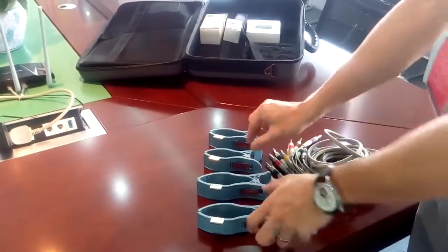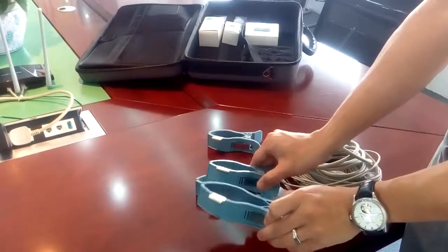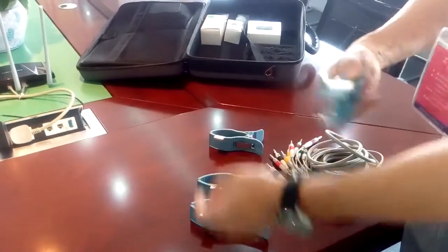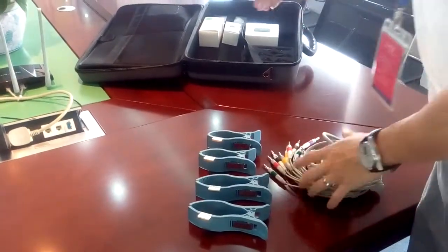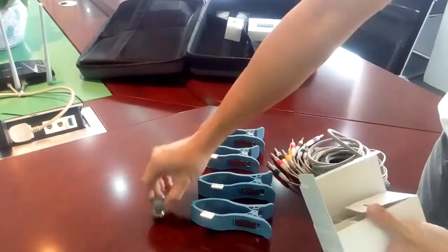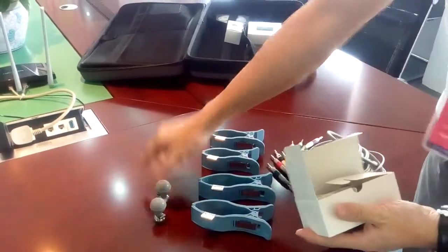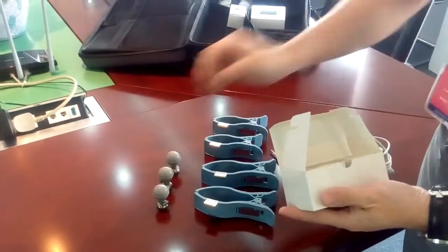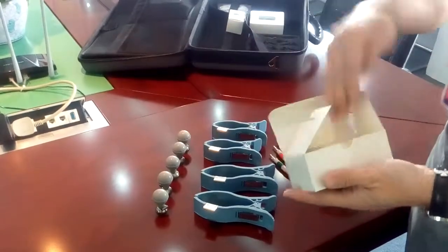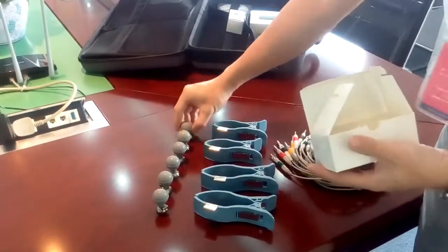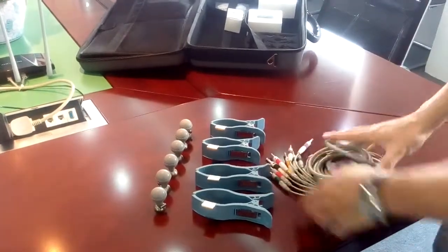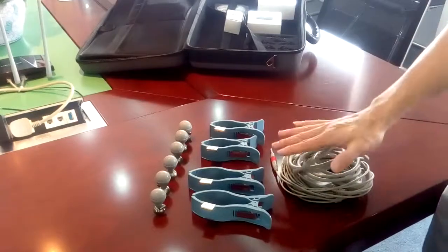This is for legs. You can see the size is a little bit bigger than the arm clamps. You have six suction electrodes for the patient's chest. So this is the standard configuration.